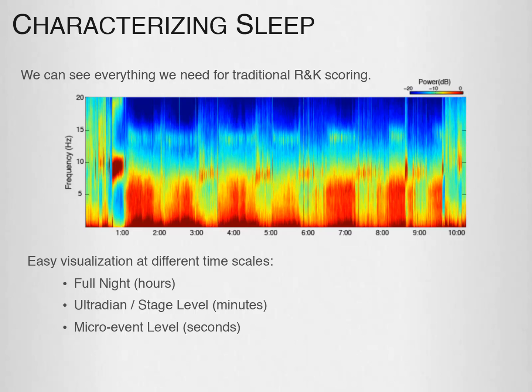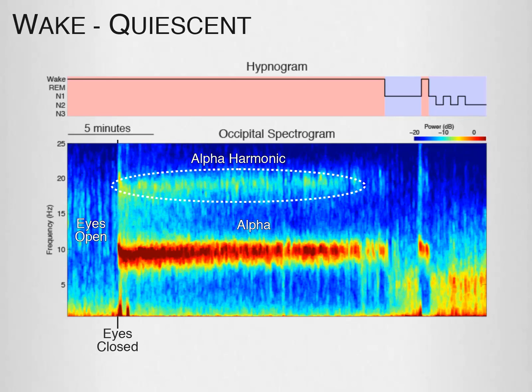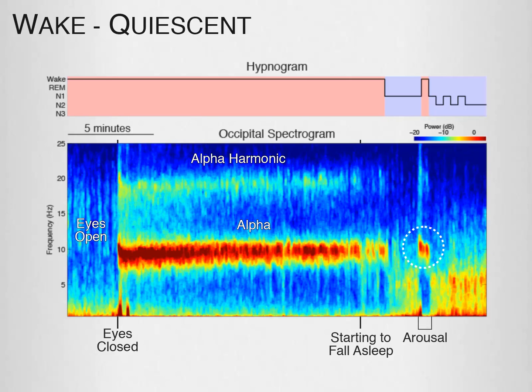Here is an example of wake EEG data. At the start, the subject is awake with their eyes open — except for some very low frequency activity, there isn't much. The second they close their eyes, we see the occipital alpha, a very strong oscillation between 8 and 12 Hz, that persists for a long time. You may also see the alpha harmonic, a low-powered ghost-like pattern of the alpha oscillation, which is an artifact created because alpha waves are not perfectly sinusoidal. At the noted point, the subject starts to fall asleep as the alpha fades, showing more power in the delta and theta range, followed by an arousal marked by the temporary reappearance of the alpha.